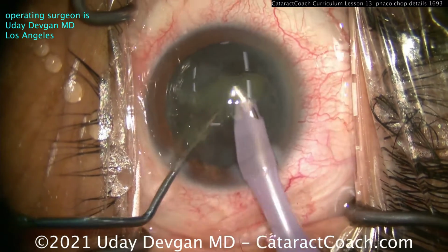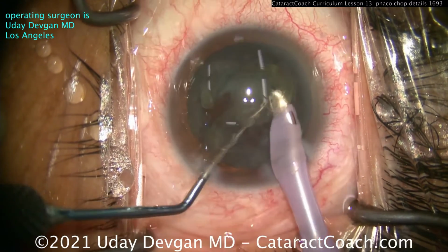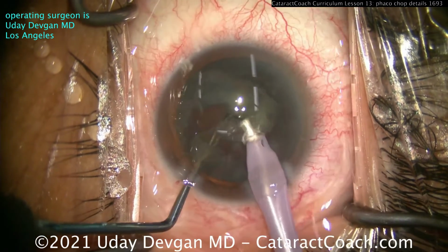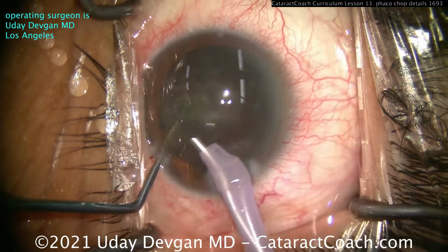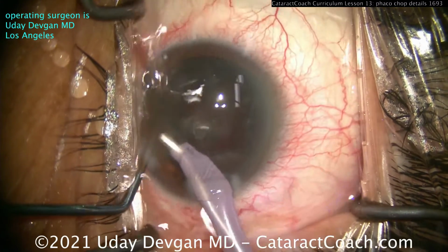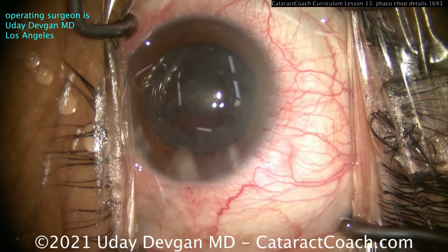Now I've gotten most of it freed up, and I'm just going to stay at the iris plane. The chopper is just keeping the pieces at the port, at the tip, and the chopper is also in that safety position so you don't allow the capsule to come forward. And let's just clean all this up, and that's how we resolved this.